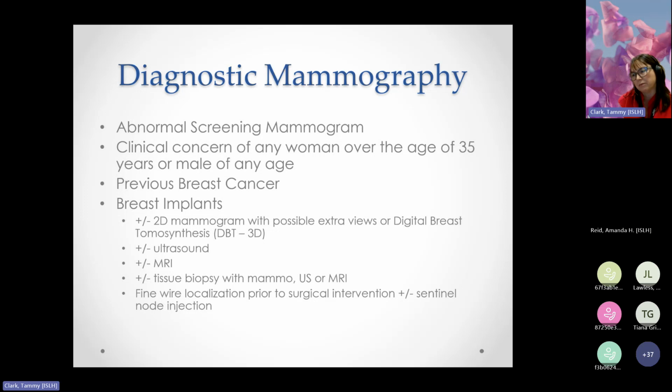Now MRI, there are 2 places on the island where we're doing MR biopsy. That's Victoria and Nanaimo. So anytime we do an MR breast biopsy, which is maybe in 2 or 3% of our patients, only if the imaging is occult on both mammo and ultrasound, and we can only see the abnormality on MRI, will we do the biopsy there. We leave a tissue clip after the MRI. So what that allows us to do is if that MRI biopsy does turn out to be cancer, there's a clip in there that we can localize with the mammogram machine using stereo or tomo biopsy and put the wire loc in that way.